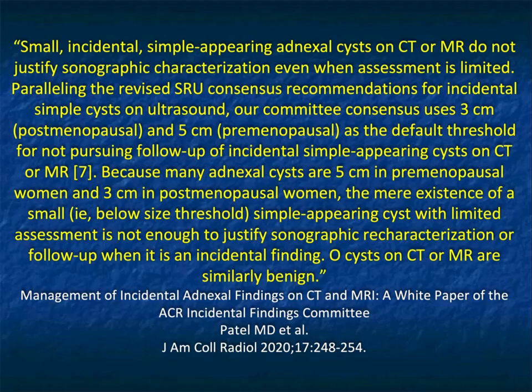Concluding, Patel makes the point, small, incidental, simple appearing adnexal cysts on CT or MR do not justify sonographic characterization even when assessment is limited. So again, this is evolving. There's still a lot of disagreement by the various organizations.